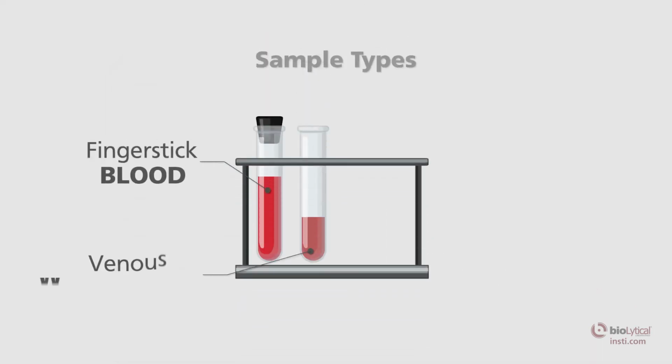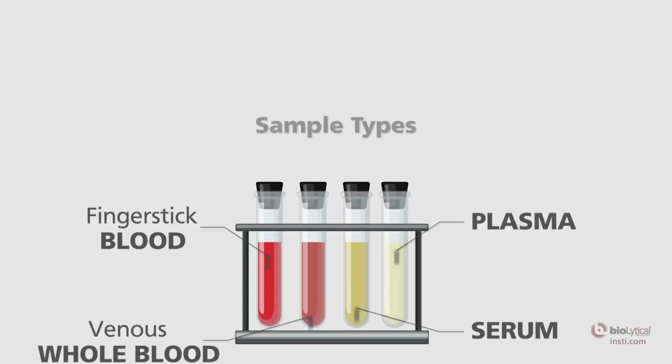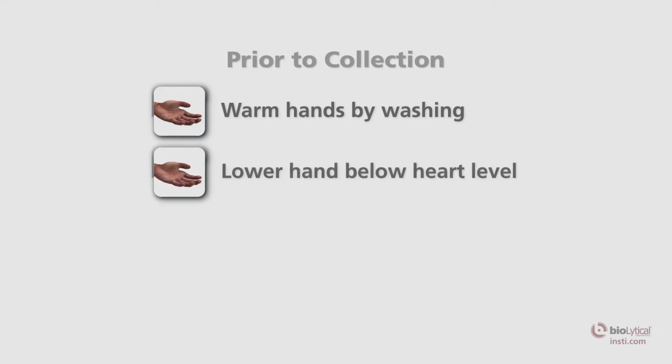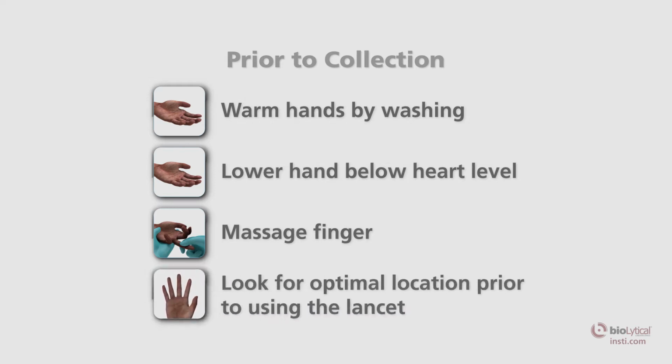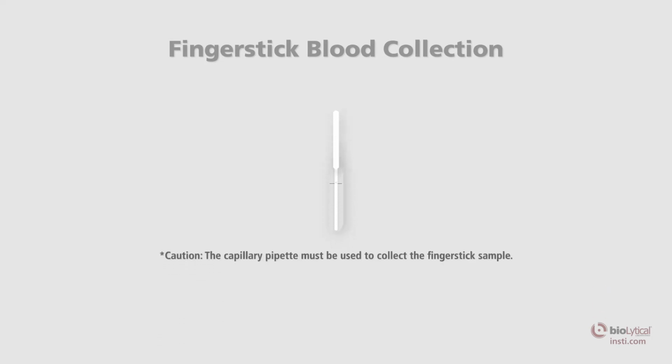INSTI can be used with fingerstick blood, venous whole blood, serum specimens, and plasma specimens. Prior to collection, warm the hand by washing in warm water. Ensure the hand is fully dry. Lower the hand below heart level before collecting a drop of blood. Massage the finger with a downward motion several times before performing the fingerstick. Before using the lancet, look for a spot on the fingertip that is smooth, not calloused, and away from the fingernail.